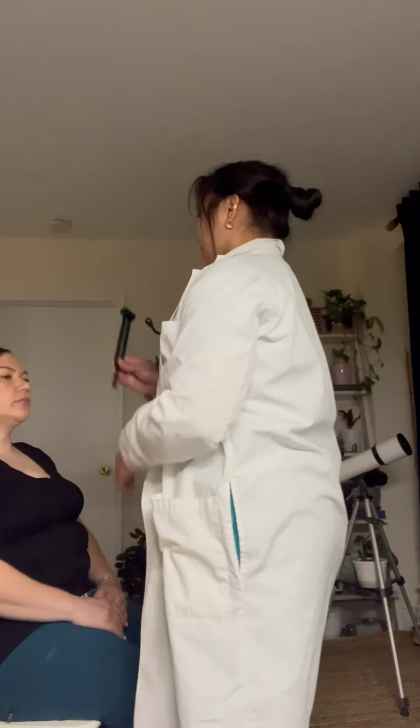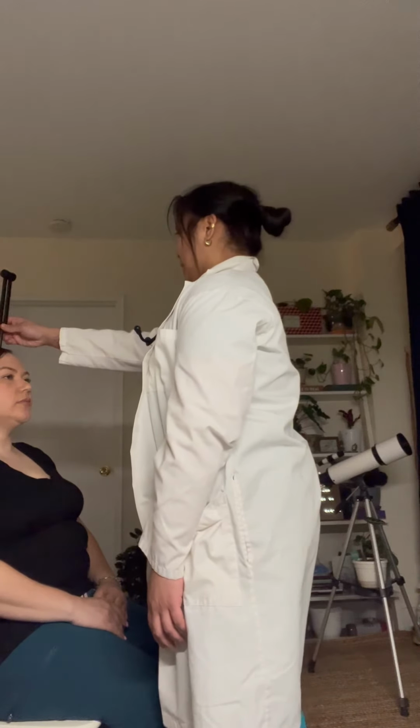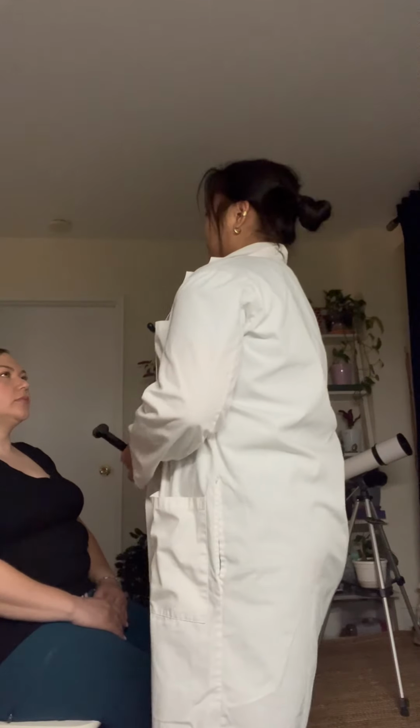Now I will perform the Weber test. I'm going to be placing this tuning fork on top of your head. Let me know if you hear in both ears. Yes. Great. No lateralization, no sensorineural loss present bilaterally.